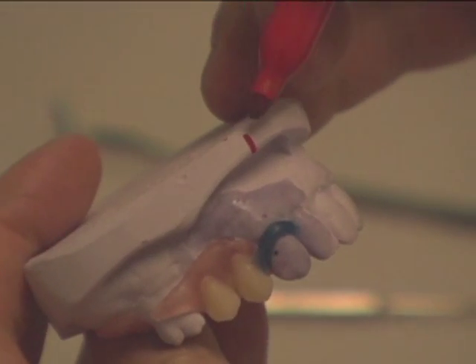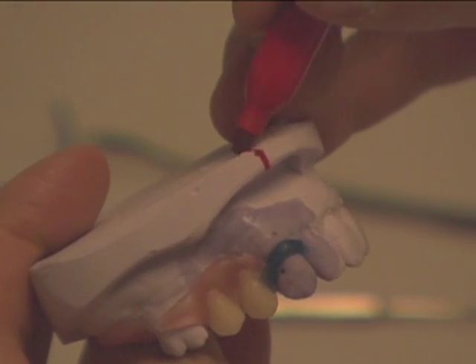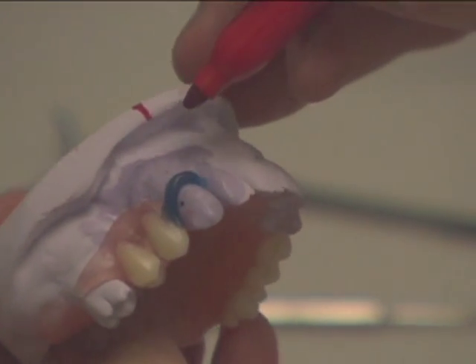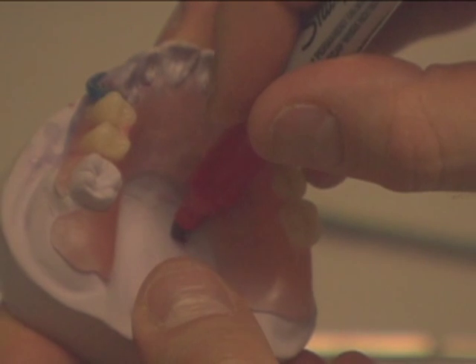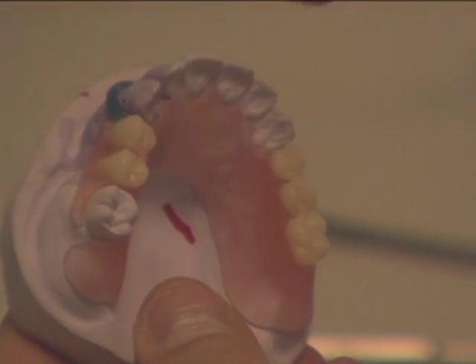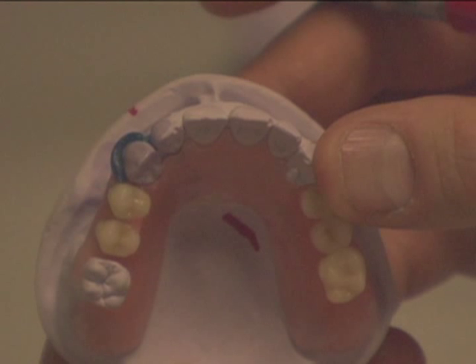Mark your model where the tips of the clasps are using a red marker. Mark a line on the front of the model and on the palate or tongue side. These lines will help once the putty is on the model — later you will have an idea where the tips of the clasps are.